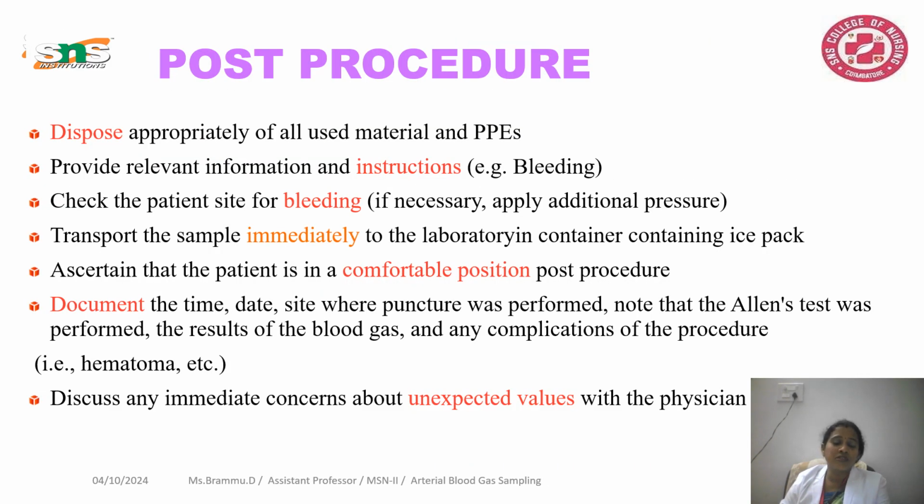In the post procedure, we have to dispose of all the materials and remove all the PPE we wore during the procedure, and check the site for any bleeding. If necessary, maintain the patient in the post procedure recovery area and check the sites for bleeding.